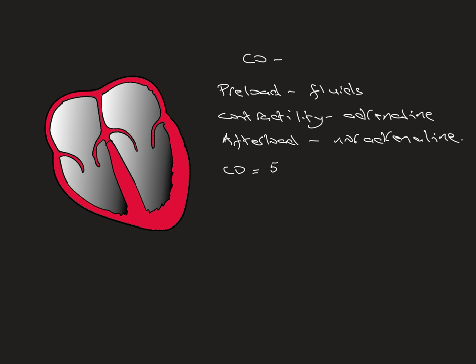However, remember on the LIDCO that we have a number called the cardiac index. Well, the cardiac index is just related to your particular patient based on their height and therefore their weight and therefore their ideal body weight. So your cardiac index is more specific to your patient, and for those values you're looking at 2.5 to 3.5. Remember also that we talked about blood pressure equals cardiac output times systemic vascular resistance.